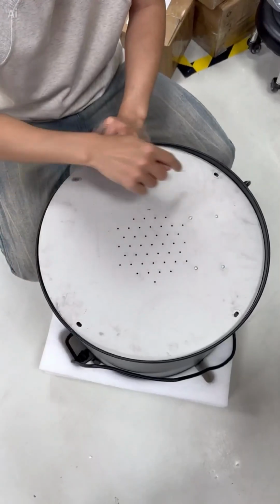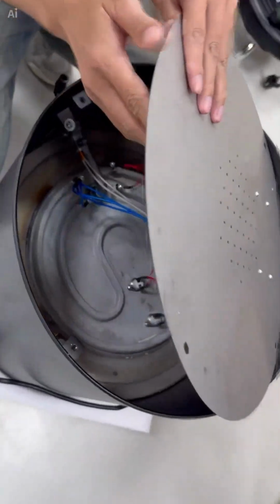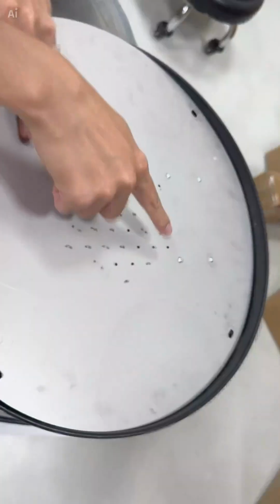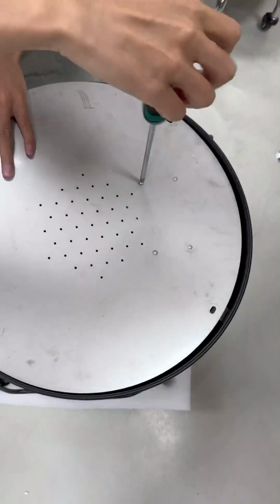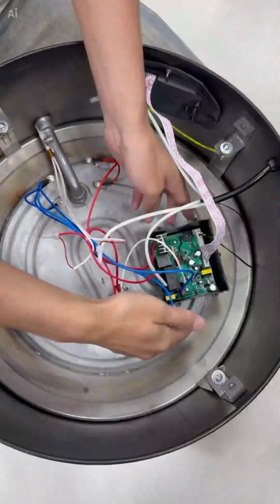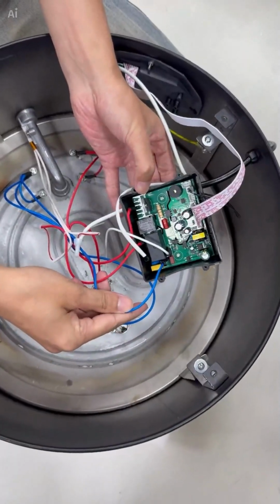After removing these 4 screws, lift this cover plate. Okay, look underneath here. This box, here at the box. Then align with these 4 screws and then remove all 4 screws. This is the wiring of the circuit board inside the open box.